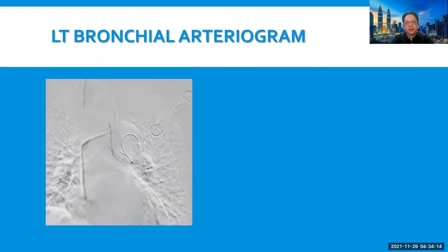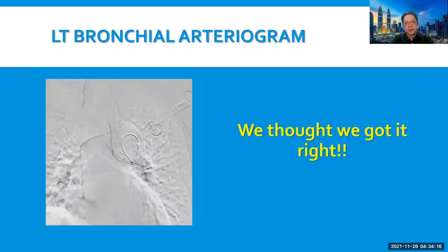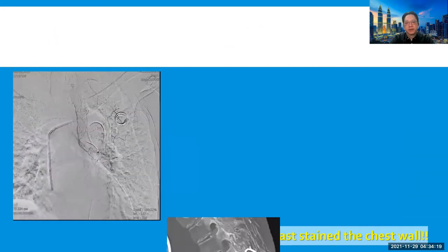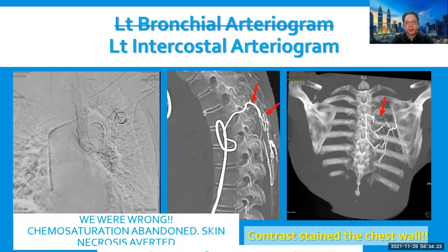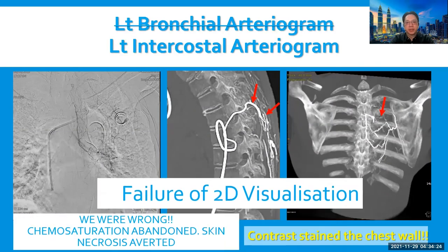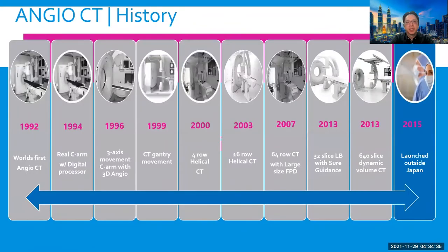On the left side, we thought it was a left bronchial arteriogram. However, on the CT scan, it shows opacification of the paraspinal muscles, and hence it was a left intercostal arteriogram. Embolization is aborted. This is also a failure of 2D visualization.